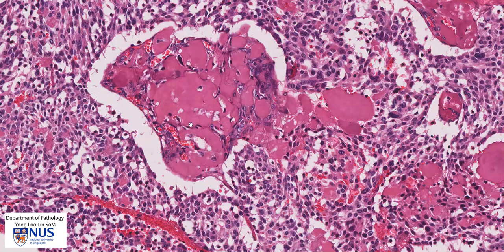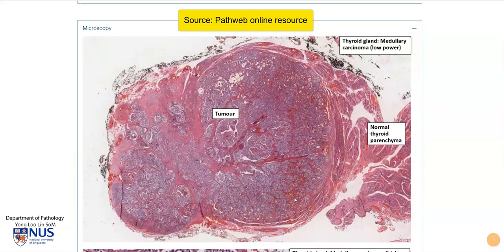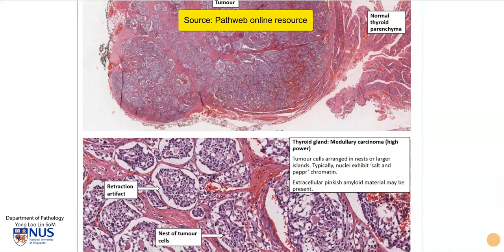This tumor would actually be positive for calcitonin, which is the endocrine product — the hormone produced by these neoplastic cells. And of course if we were to stain this with an amyloid stain, for example Congo red, we would see the classical appearance, and I'm going to show you this now. These are annotated pictures taken from the same case, from PathWeb, and we can see that the tumor cells have been labeled.